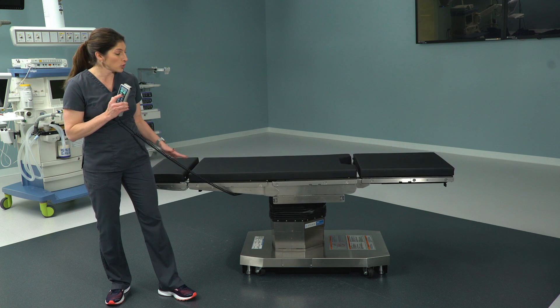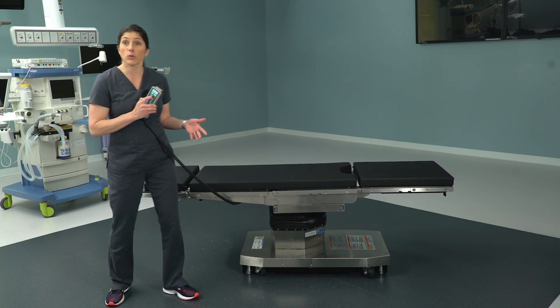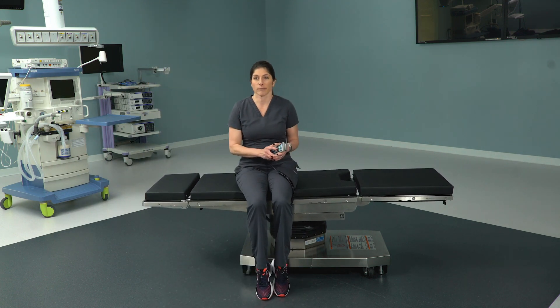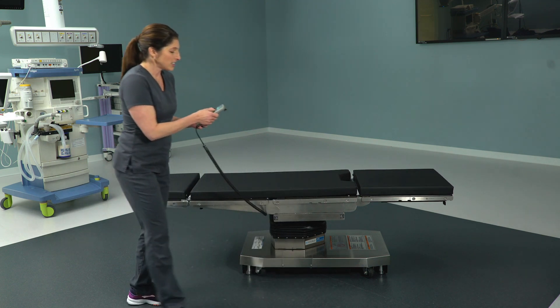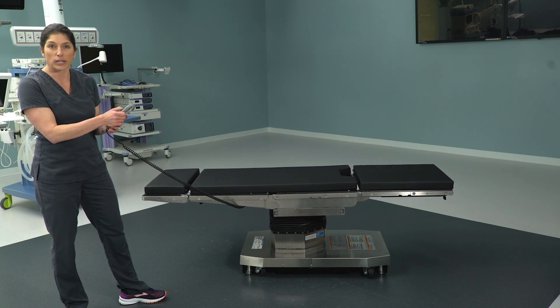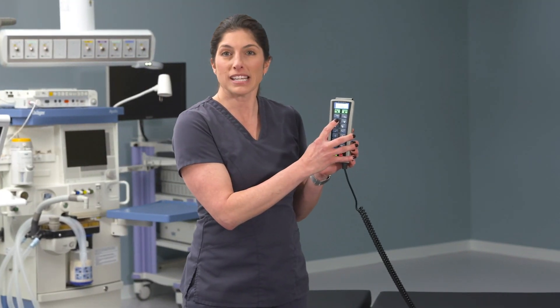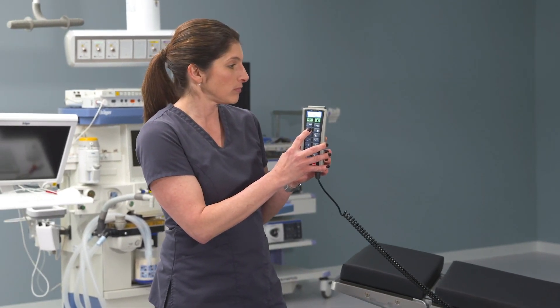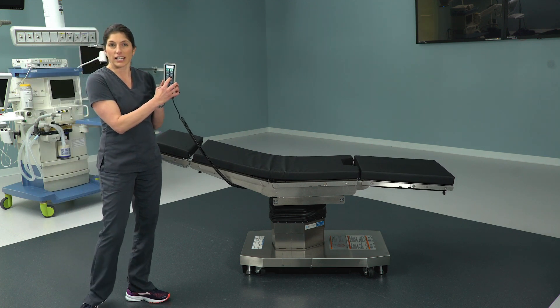You'll notice immediately — you probably won't bring a patient in ambulatory, but if you wanted to you could have them sit right down on the surgical table and lay down, much easier than transferring. So we've got height up and down, low height of 22.8 inches. Next we have back up and down, we have leg down and leg up.